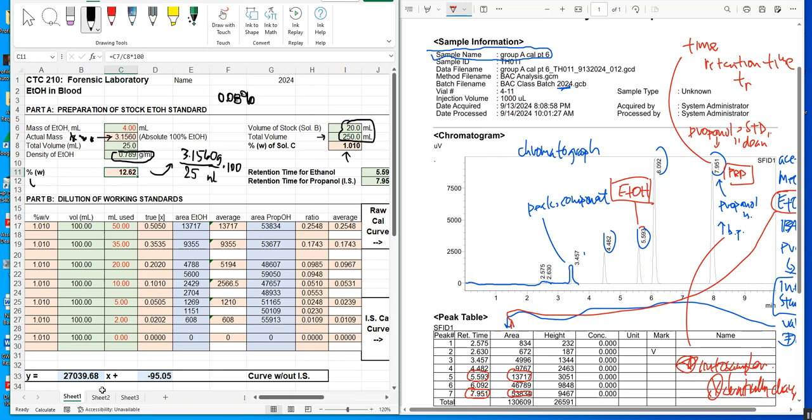Maybe you didn't do another 20 to 250 mil dilution. If you didn't, you leave it out. If you did, but it was different, you put the numbers that we used in there. Maybe it wasn't 20 mils. Maybe it was 10 mils instead. Maybe it wasn't 250 mils. Maybe it was 100 mils instead. Again, your video will tell you that information on how we prepped these standards.